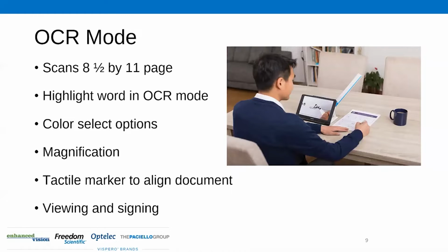One of the features that the Compact 10 has with the OCR mode is it can actually scroll one single line of text across the screen in any magnification size, digitized, which makes it far easier for some users to get access and follow that reading. And they can select any reading speed they wish, so they can make it very comfortable for getting access to that print.